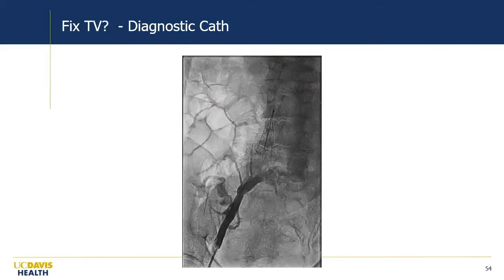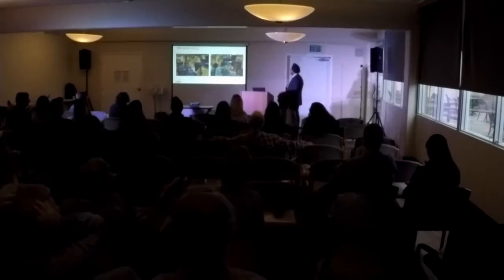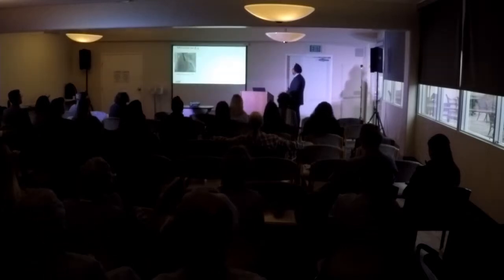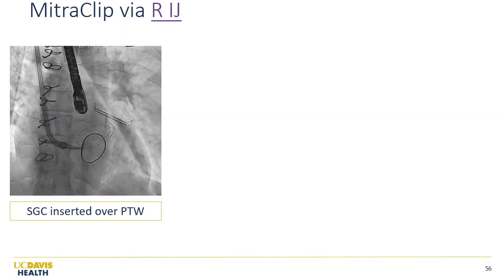So guess what? We did the whole mitral clip from the neck. Probably one of the first ones in the world that we were able to successfully do, all from the patient's neck. Here's the patient's head. This is us at the head of the bed. The anesthesia guys are here at the foot of the bed. The imaging guys are right behind us. The patient's feet are here, and we're staring at the screen, standing with the patient's head right there. And we're coming in from the IJ.